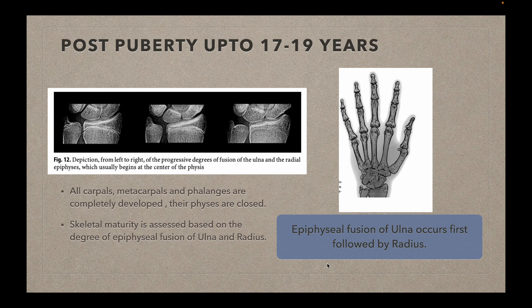The last stage is the post-pubertal stage, up to 17 to 19 years. During this stage, all the carpals, metacarpals, and phalanges are completely developed and their epiphyseal plates are closed. Skeletal maturity is assessed based on the degree of fusion of the epiphysis of the ulna and radius. Epiphyseal fusion of the ulna occurs slightly earlier compared to the radius. In the picture, we can see progressive fusion of the ulna and radial epiphysis from left to right, beginning from the center and going laterally. This is how we can estimate age based on x-rays of the hand and wrist. Thank you very much.